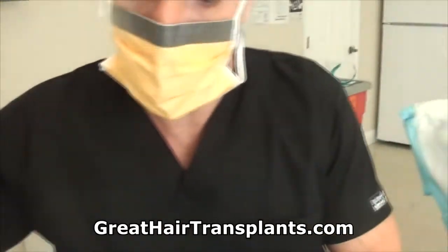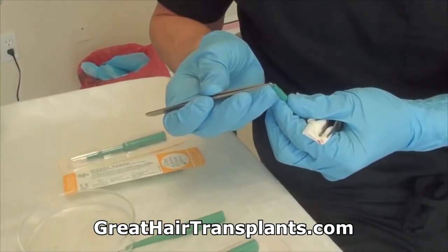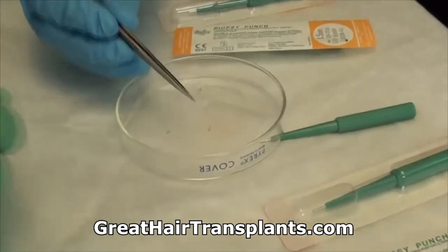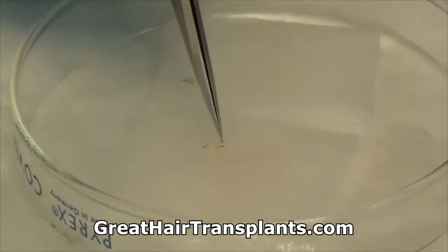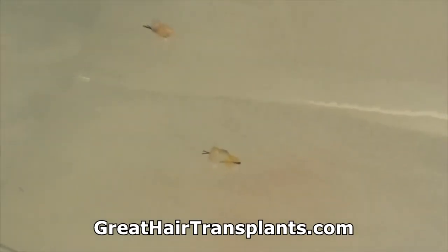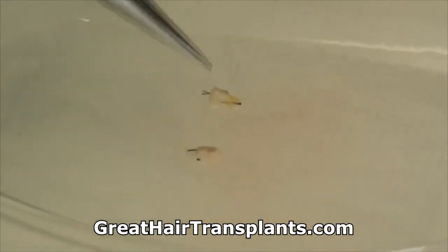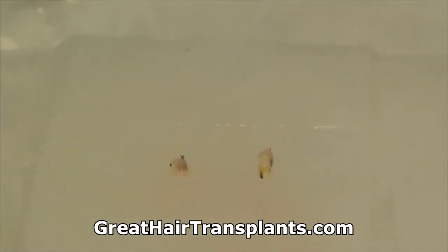So now it's in my instrument. Right? I didn't do anything different. Now the follicular unit's now in my instrument. I pulled it out. Okay, now look at it. This is what happens. We pulled it out. We have the bulb down here of one. We've now transected this other follicle. Okay, so my first shot, all transection. Second shot, let's take a look at that. Bulb transection. So there's two shots.